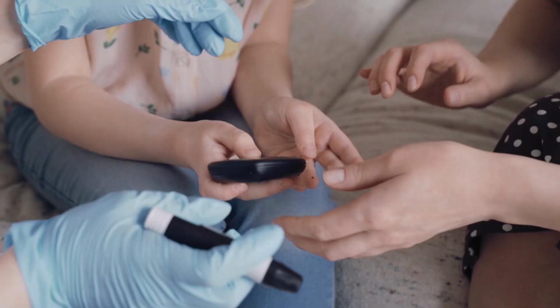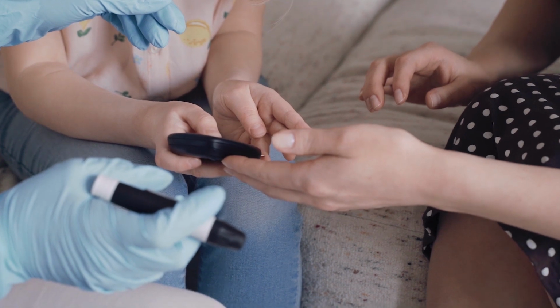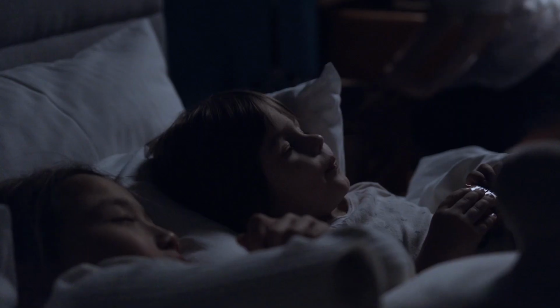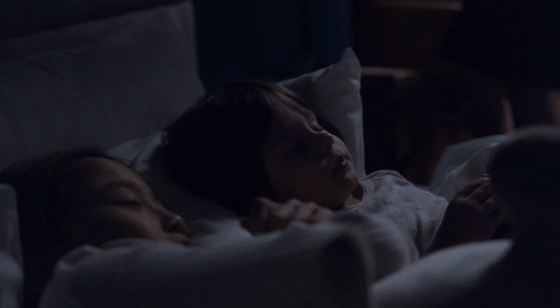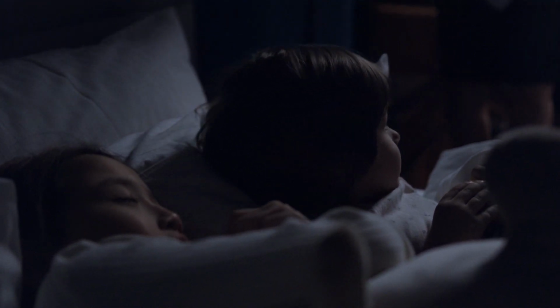The next will be biochemical monitoring. These sensors measure specific biomarkers in bodily fluid, such as glucose levels for diabetics or lactate levels for athletes. The next one will be sleep and stress monitoring. Wearable devices that track sleep patterns, detect stress levels and provide insights into mental well-being belong to this category.